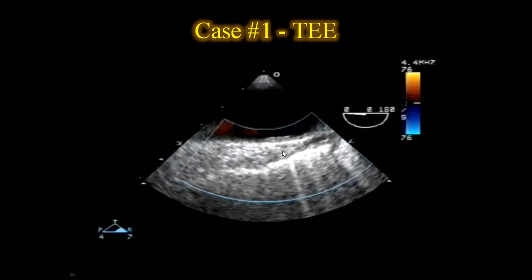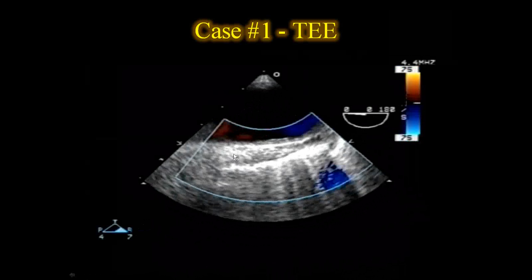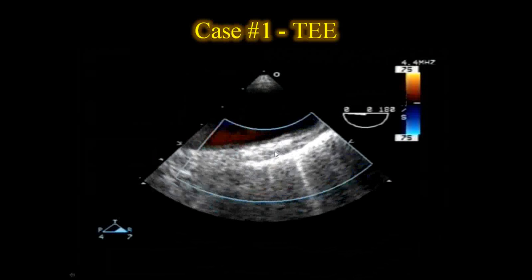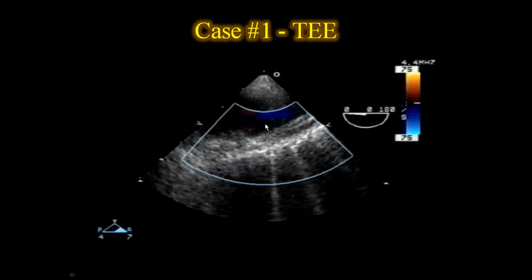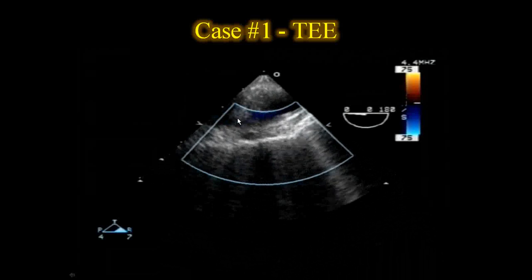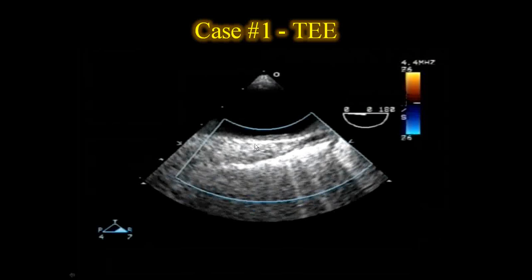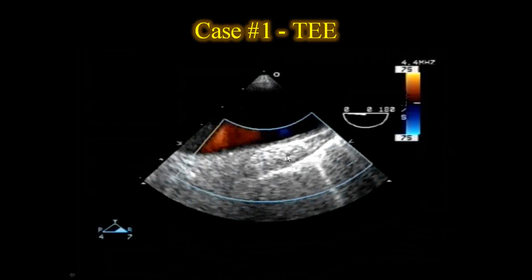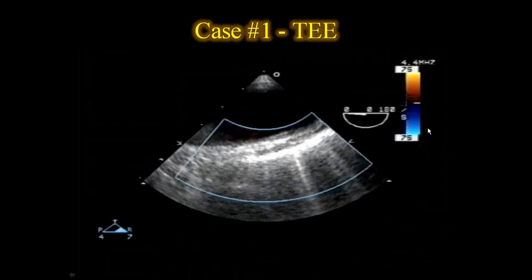In the long axis, it is clear that there's an echogenic signal here consistent with hematoma. There's some clotted blood. Fluid blood remains non-echogenic or echolucent, the darker signal. And with color on here, we don't see any flow acceleration in this collection, which is a good sign.